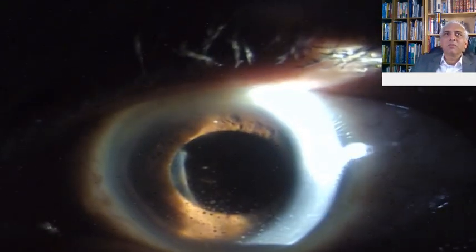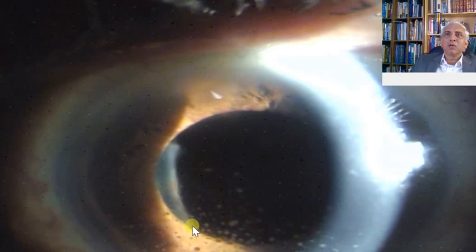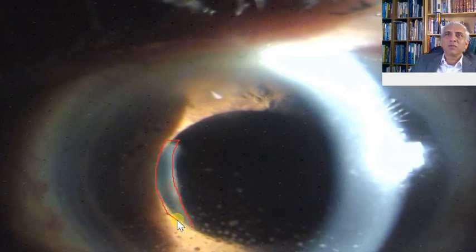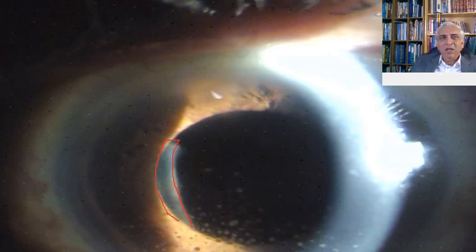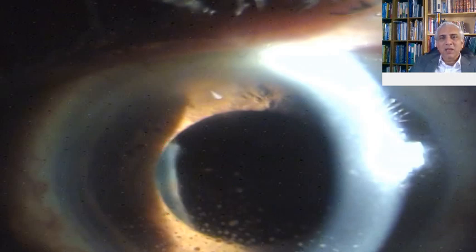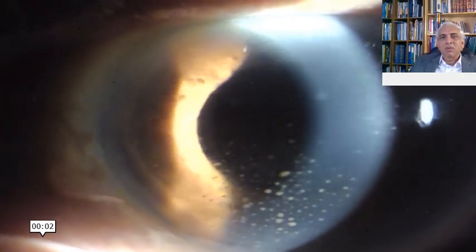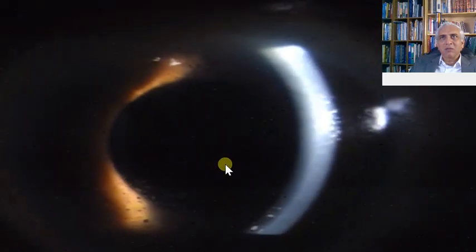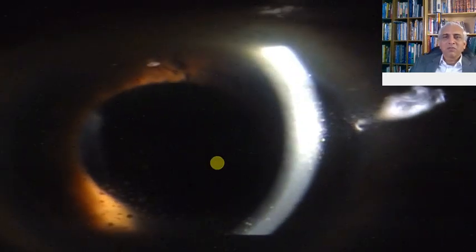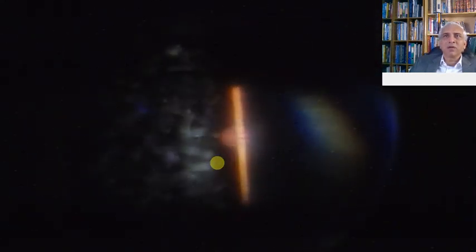At higher magnification, this is a remnant of the posterior capsule, meaning the IOL is probably on the sulcus in this patient. The anterior chamber seems deep in its shape. With oblique examination, bringing down the light, I'm scanning the area of the cornea for KPs, then checking for uveitis. The red reflex is very important, and then looking at the fundus and vitreous.